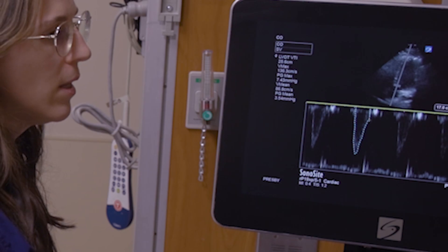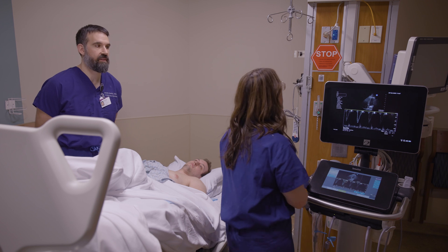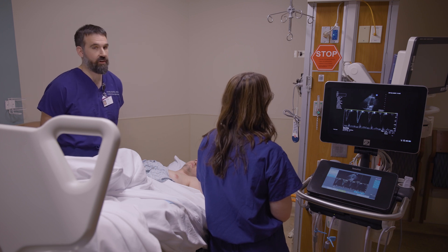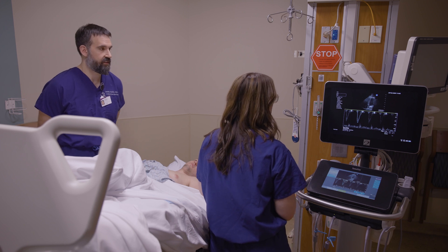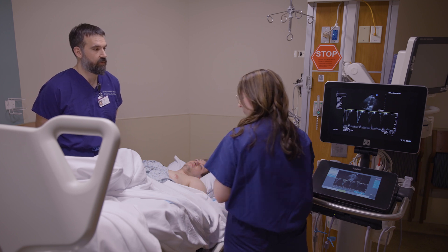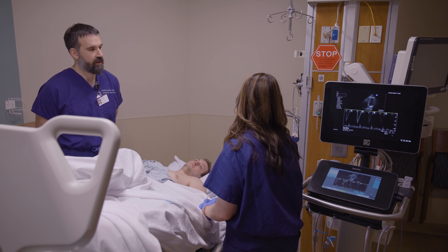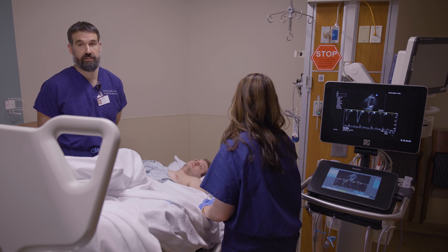Our last value was 24.1, and now it's 25.6. A change of about 10% to 15% is typically the cutoff in the literature for deciding that somebody is indeed volume responsive — meaning if stroke volume increases by 10% to 15%, that suggests the patient is fluid responsive and one could consider giving a fluid bolus. In this case, our patient did not meet that threshold, which, depending on the clinical circumstances, would be evidence to withhold fluid and think about other ways to manage hypotension or shock.